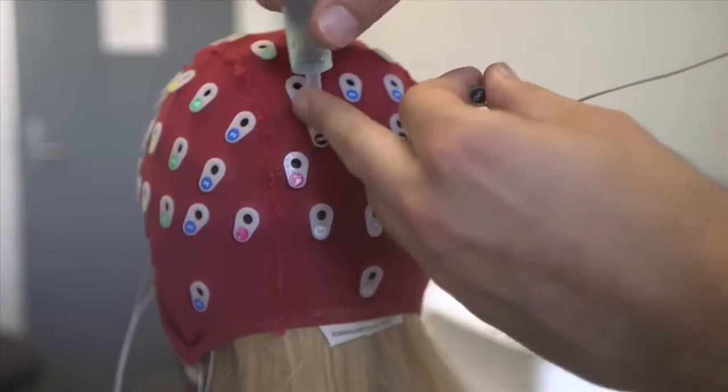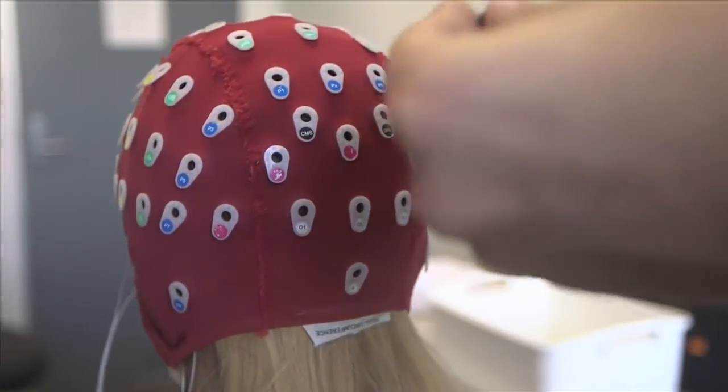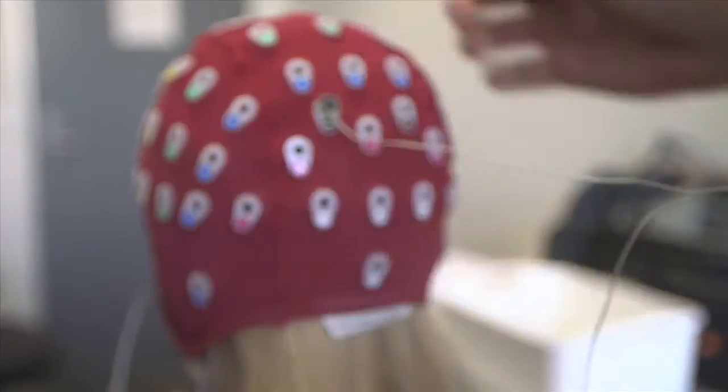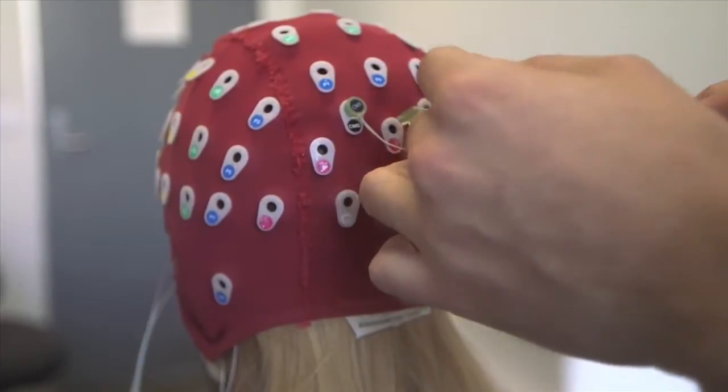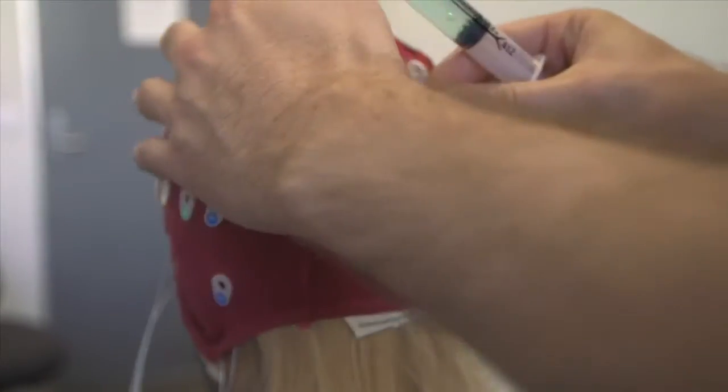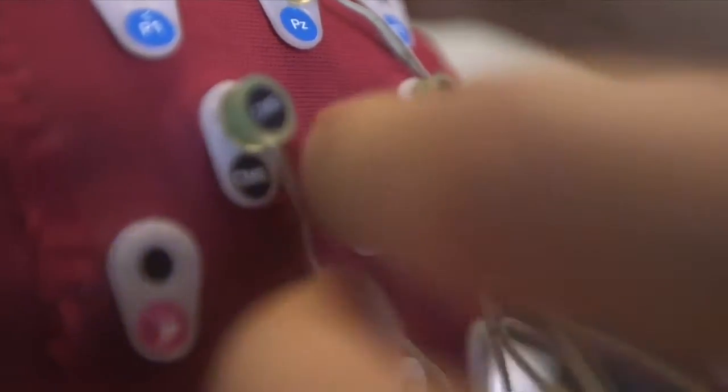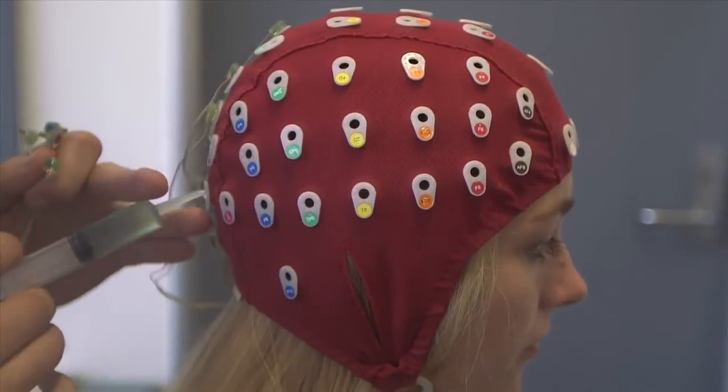You are now ready to attach the electrodes. Do one side at a time, start at the back of the head, and attach the electrodes in the same order as they are ordered on the cable to minimize tangling. Carefully poke the tip of the syringe all the way to the participant's scalp, and gently move it around to push hair out of the way. Start to administer gel as you pull the syringe out to make sure that there's no empty gap between the scalp and the electrode. Then repeat this 64 times until the entire cap is completed.